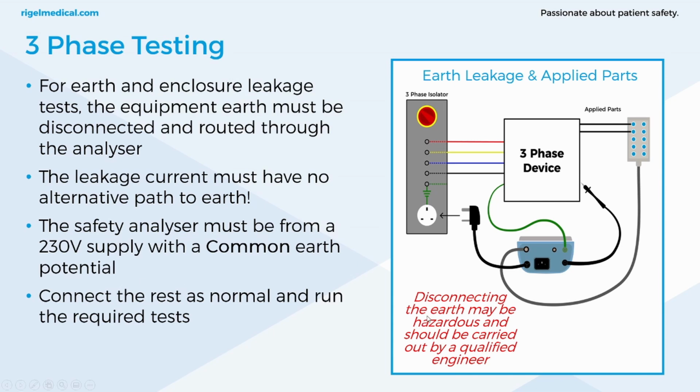One important note as well, three-phase distribution systems are used as they're more efficient for high power devices such as MRI and CT. They need that power, but obviously because of that power they're considerably more dangerous. In the UK it operates at around just over 400 volts and should only be changed or modified by a fully trained and qualified engineer.